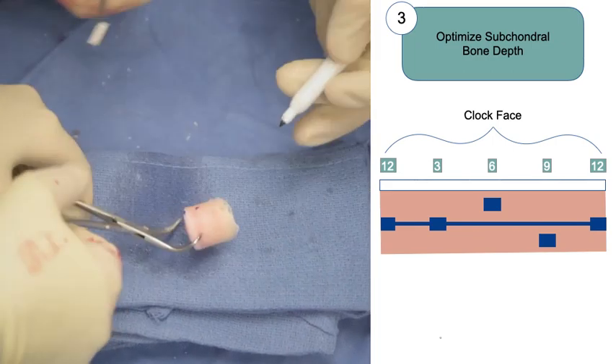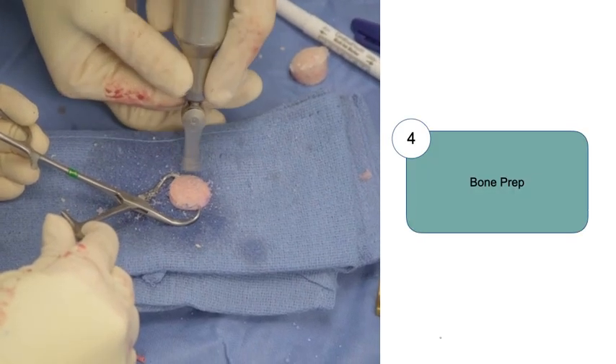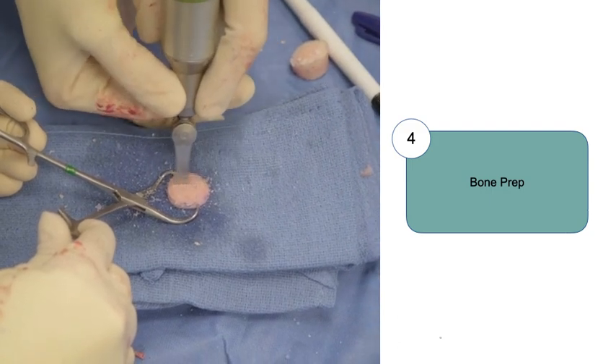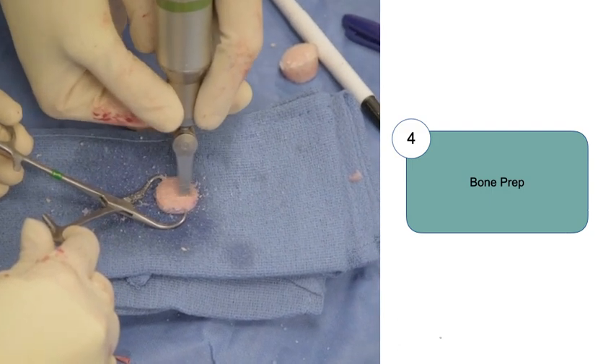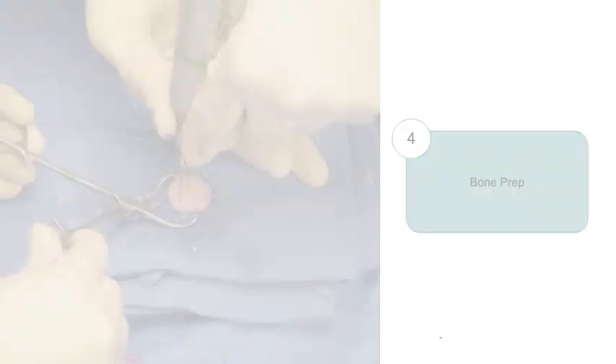Understanding the orientation of the plug is critical for proper orthogonal graft placement. We then prepare the bone. The edges of the bone may be chamfered if preferred to facilitate graft insertion, and grooves are created within the bone with an oscillating saw. Doing this may decrease the force of impaction, improve deep zone access with graft cleaning techniques, and facilitate removal of the graft if necessary.